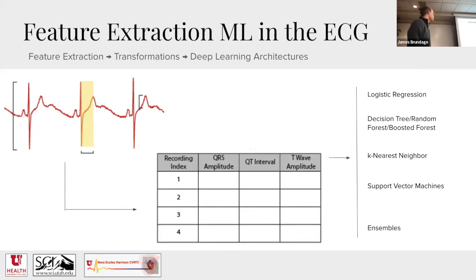And for lots of problems, this actually performs pretty well. It tends to perform well for problems where we understand a little bit the association between these features and what's going on, and less well on novel signal discovery problems. Other advantages of this include that they tend to be computational.